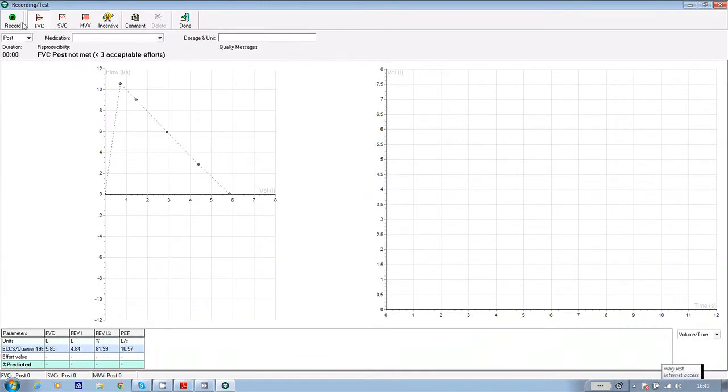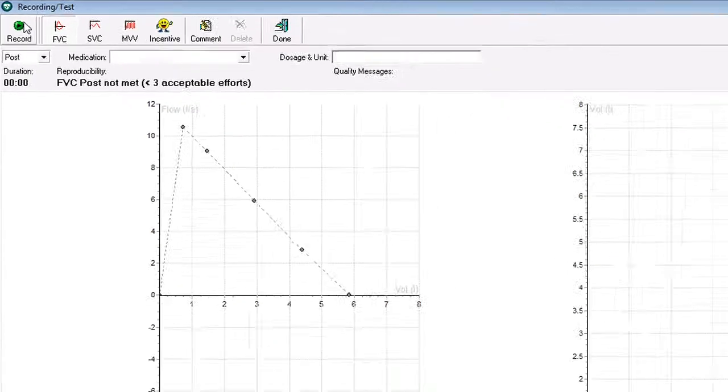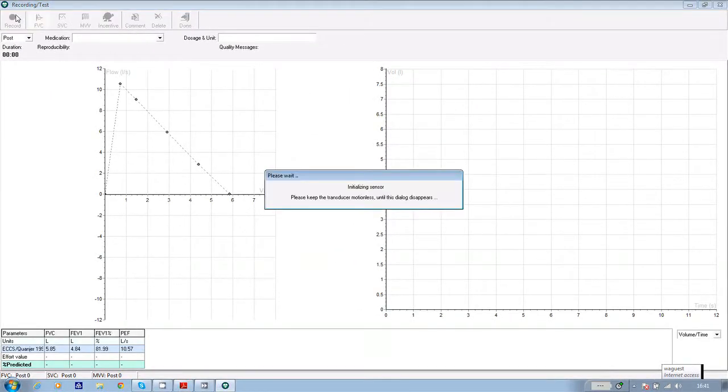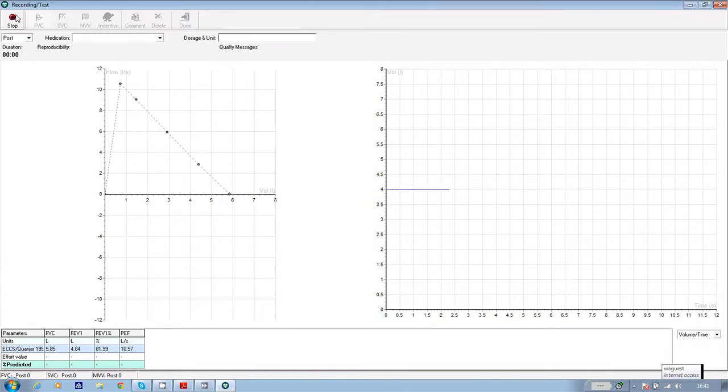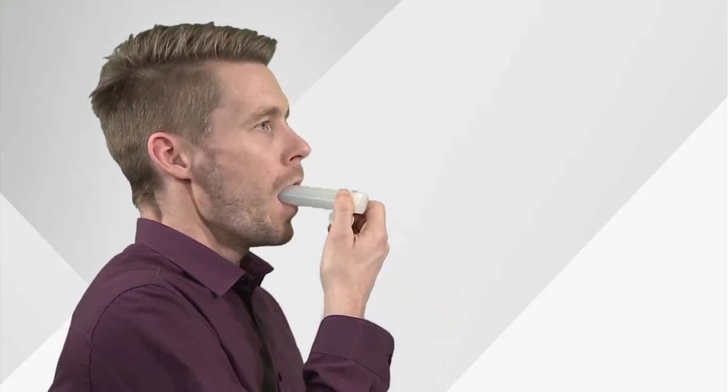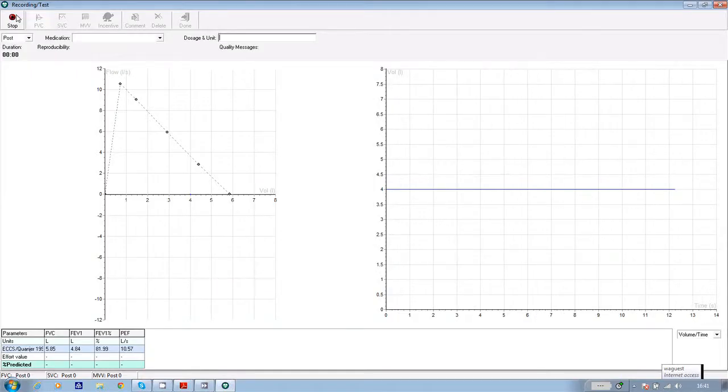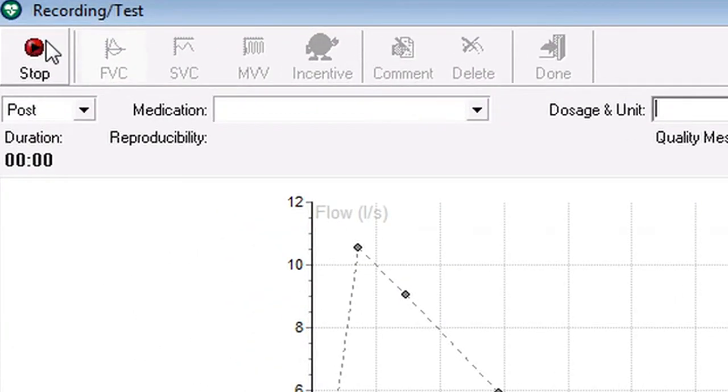And then to complete the reversibility test, click on record in the top left hand corner of the screen. When the stabilizing flow sensor message disappears, ask your patient to pick the flow sensor up, place it in their mouth, and blow out as hard as possible. When they've completed the effort, click on stop.